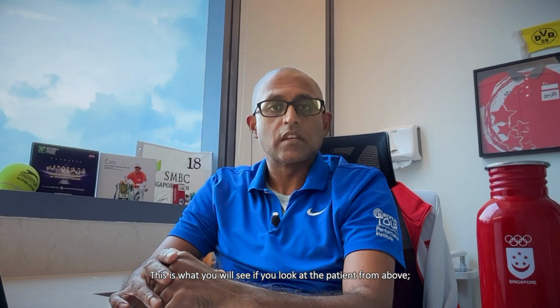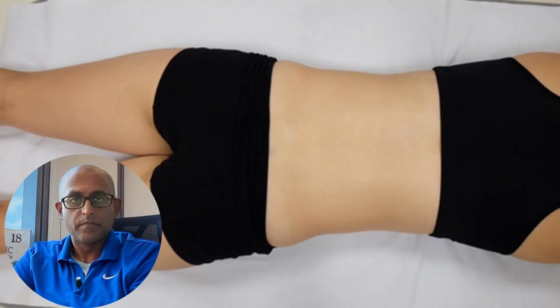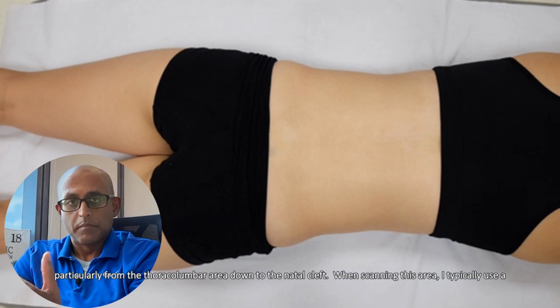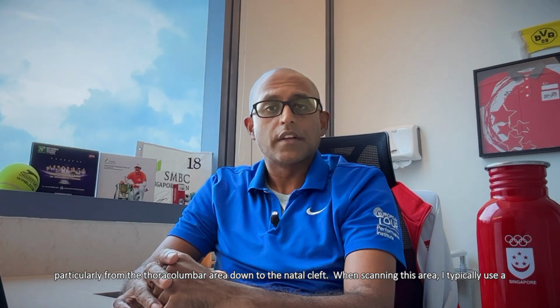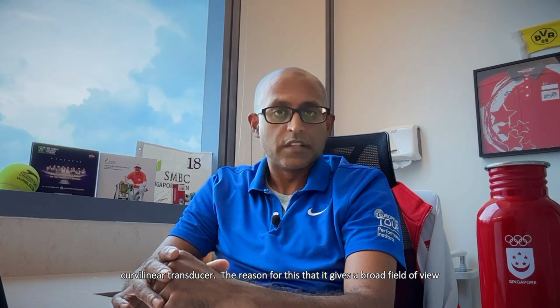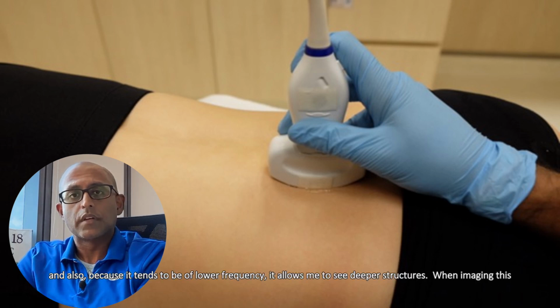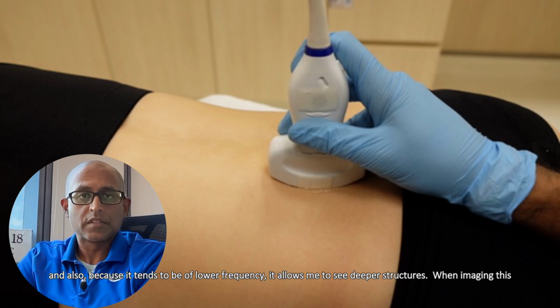And this is what you will see if you look at the patient from above. It's important to expose the back as much as possible, particularly from the thoracolumbar area down to the natal cleft. When scanning this area, I typically use a curvilinear transducer. The reason for this is that it gives a broad field of view, and also because it tends to be of lower frequency, it allows me to see deeper structures.